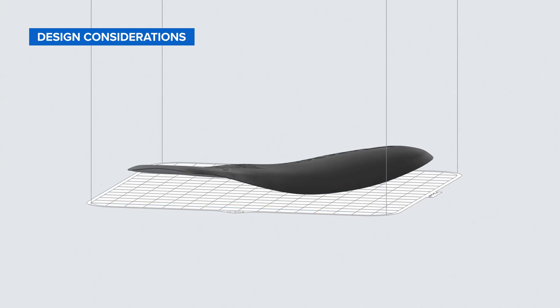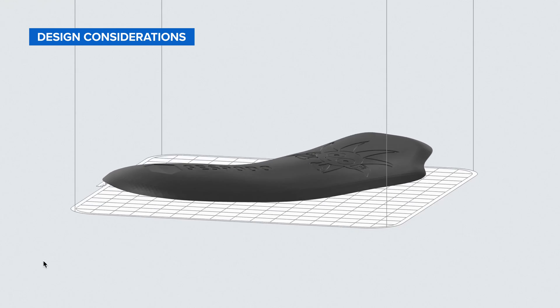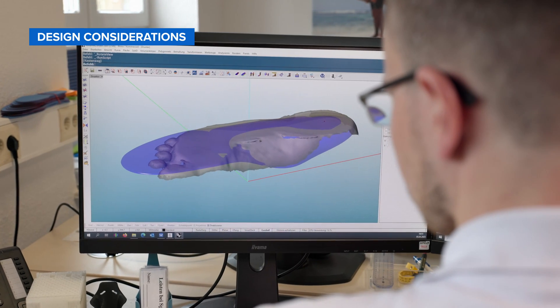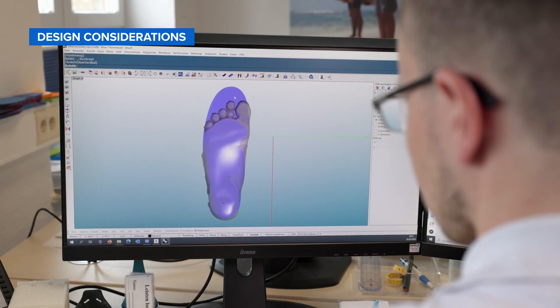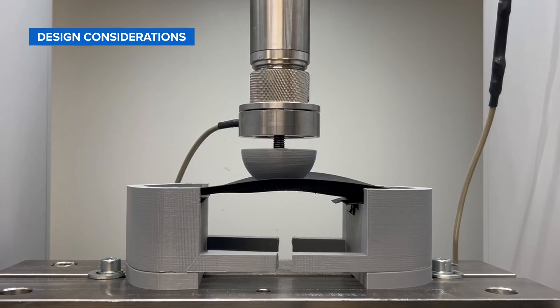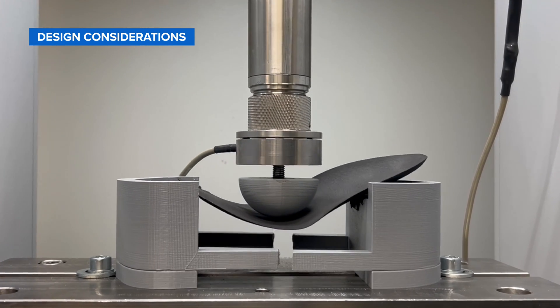Before you start printing, you'll need a printable design. Depending on the design, you can print insole shells in all standard shoe sizes up to 36 cm in length. We suggest designing your insole shells with a thickness between 2–3 mm, as these were validated to withstand 4 million bend cycles in third-party bend tests.